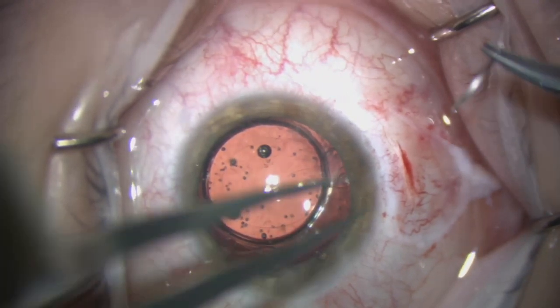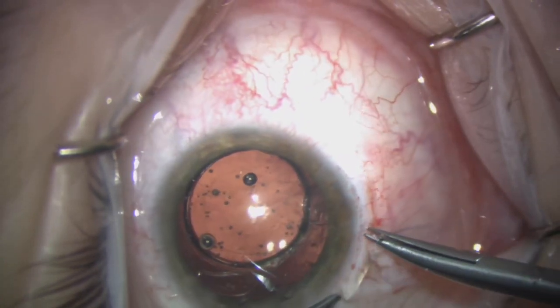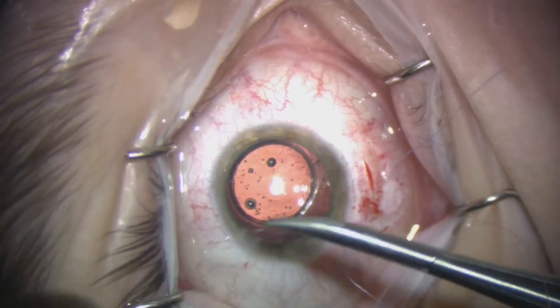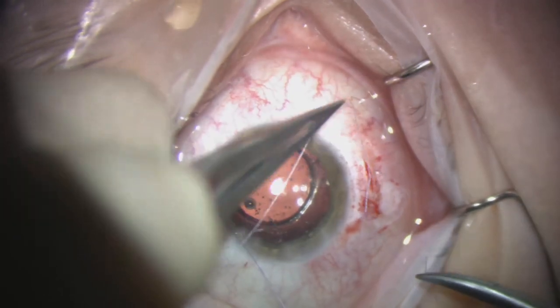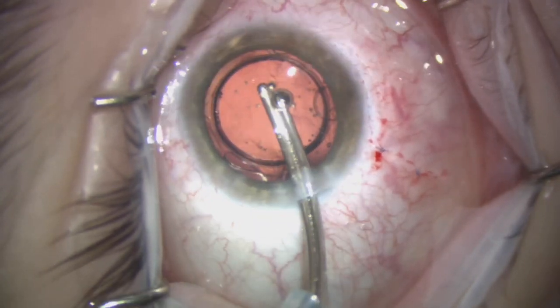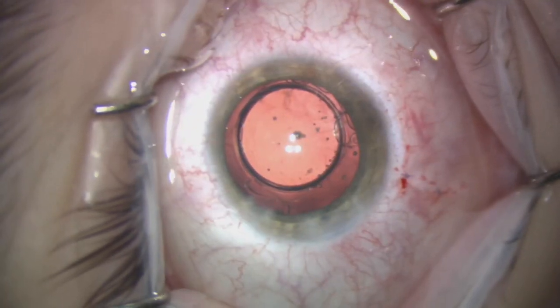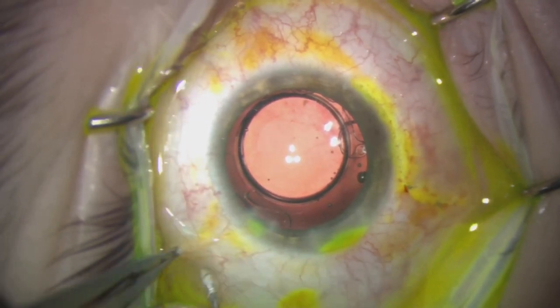At the conclusion of the case we close the conjunctiva with 8-0 Vicryl. The lens is nicely centred and we check the wounds with fluorescein. After removing all of the viscoelastic — using a SIMCO cannula for very controlled and gentle removal — we inject some antibiotics into the cul-de-sac. That concludes the case. Thank you very much for your attention.